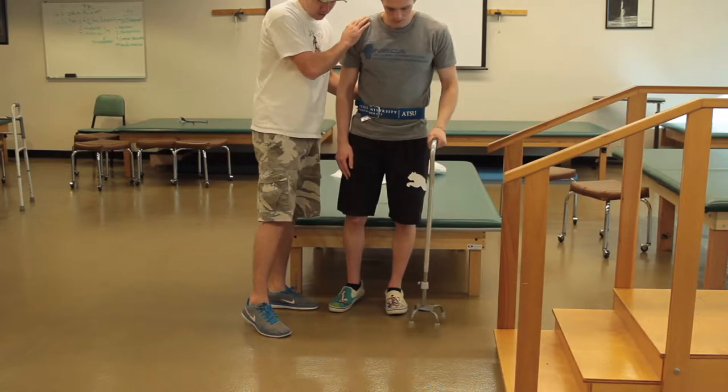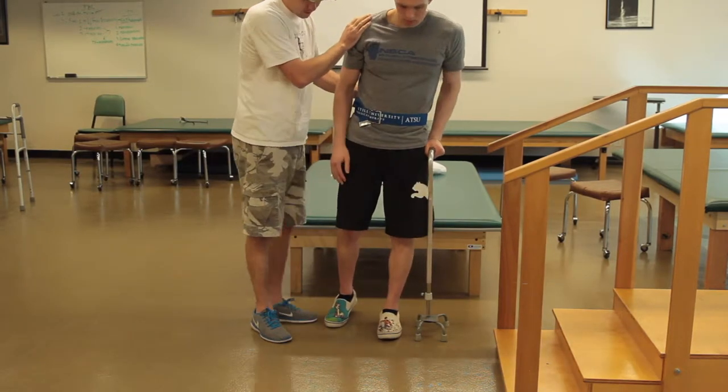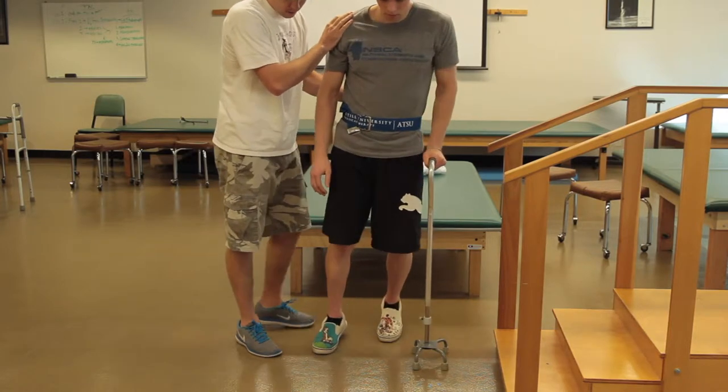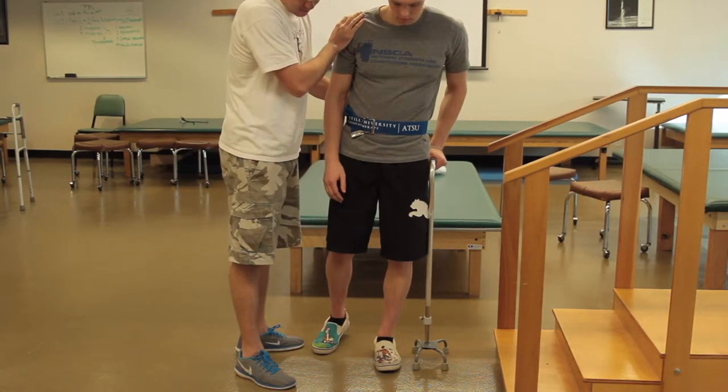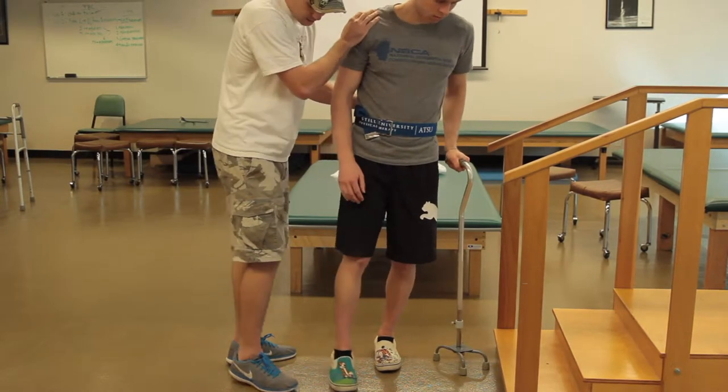So now let's go forward. So cane, this side. And this side. Yep, and then there you go. Okay, perfect. So go ahead and take a left turn. We're going to go up the stairs right there. So same thing, cane, bring that around.